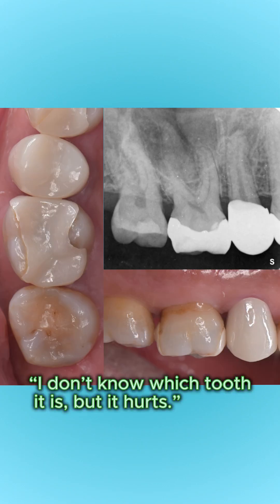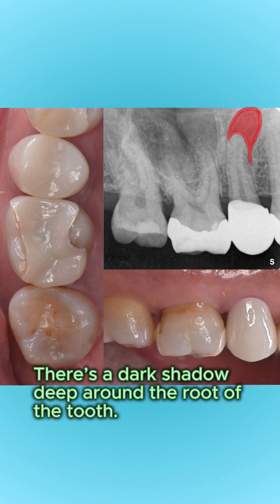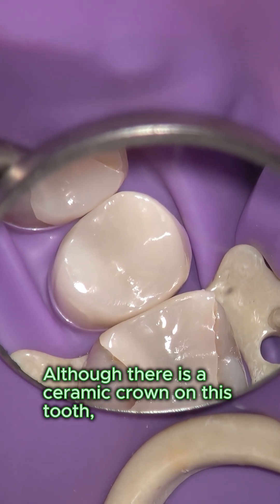The patient said, 'I don't know which tooth it is, but it hurts.' There is a dark shadow deep around the root of the tooth. The dental pulp in this tooth may already be non-vital, although there is a ceramic crown on it.